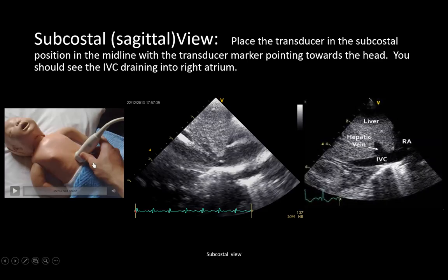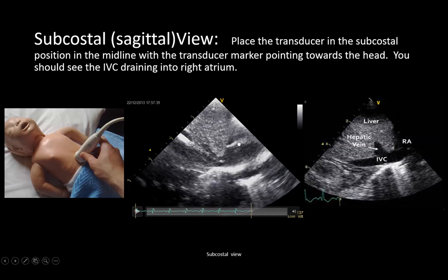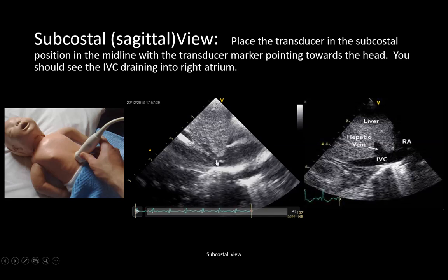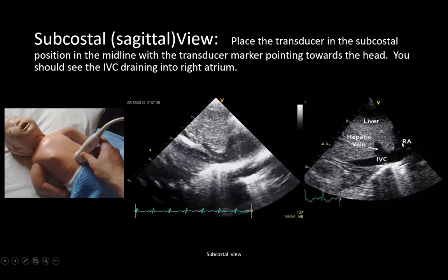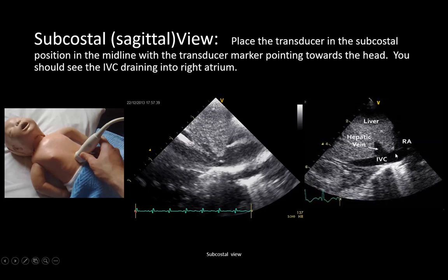For the subcostal view, the probe is placed at the subcostal area just below the xiphoid process with the probe marker facing the 12 o'clock position. You will see the liver on the right side and the heart — the entrance to the right atrium — on the left. The IVC is visible, and we aim to keep the catheter tip just outside the heart at the IVC–RA junction.